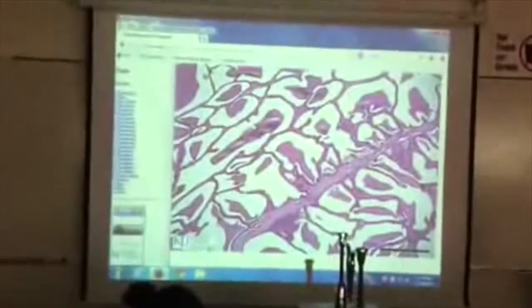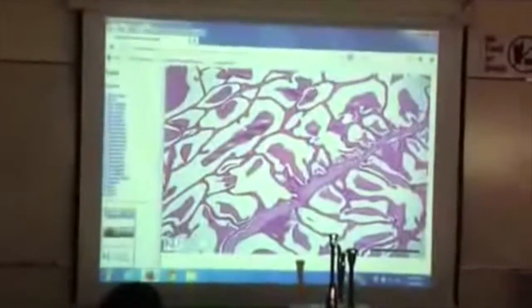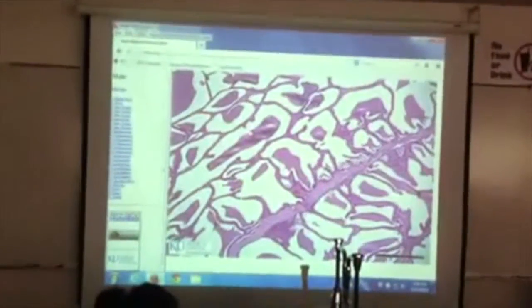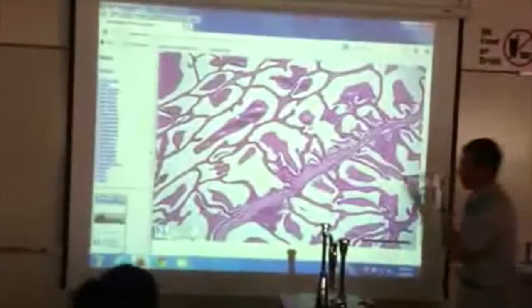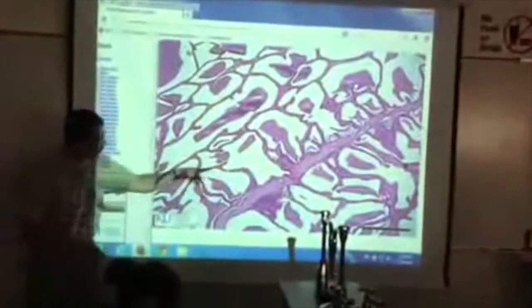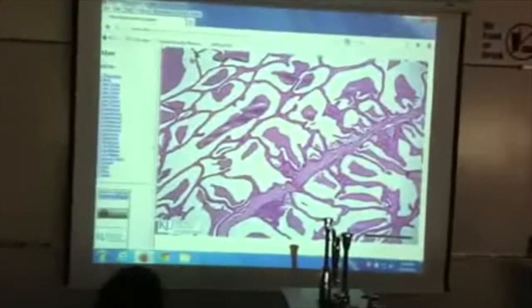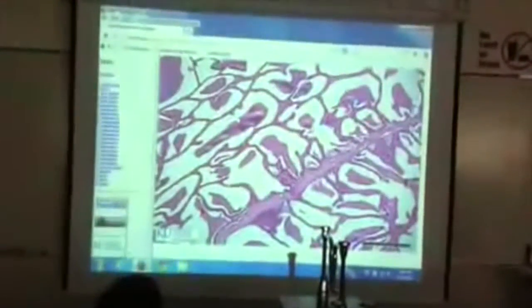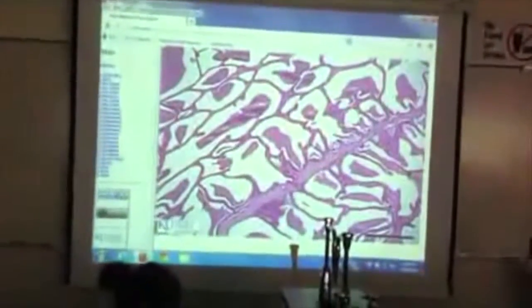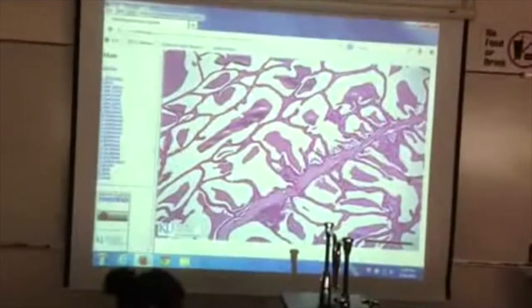What do you think it would look like based upon the models? Lots of fluid. Lots of white space. Looks like a sponge or a honeycomb. Sponge, yeah. Because the things you see on the models are trying to represent this look. It looks like a sponge, honeycomb, some kind of abstraction. But you're going to see lots and lots of these funny looking, spongy looking things. So what do you call those spongy looking things formally? Mucosal folds, because they're full of mucus. Looks like a Dali painting. Sure. Yeah. Whatever will get you there.